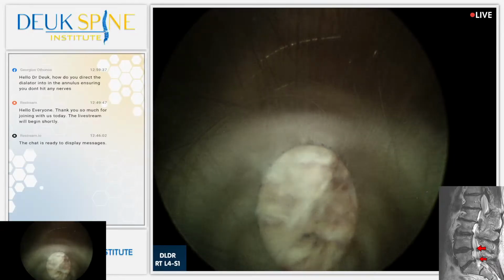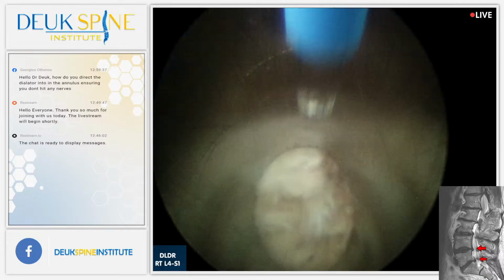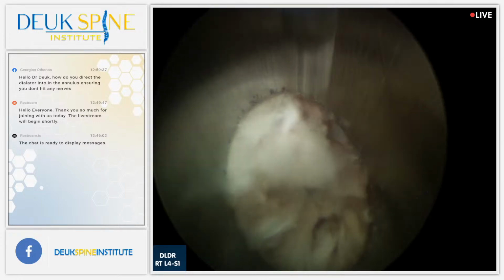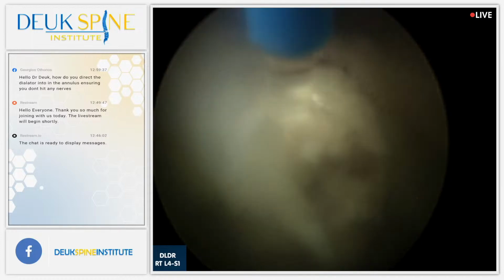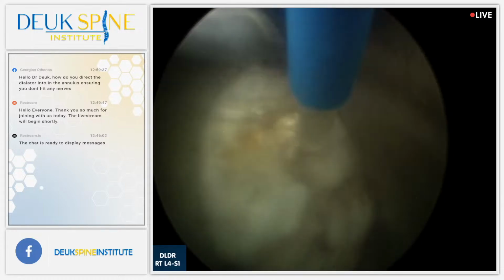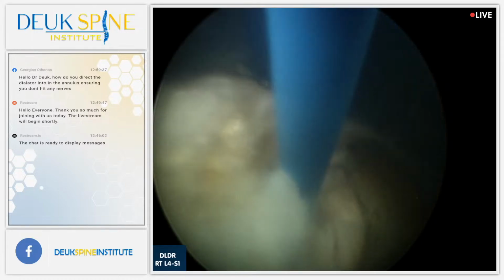Okay, welcome back. You understand how these discs cause so much pain. Well, there it is. Look at that pink tissue. That's the inflammatory tissue. You just saw it on your video. That's what we're here to clean out. That's where the pain comes from.